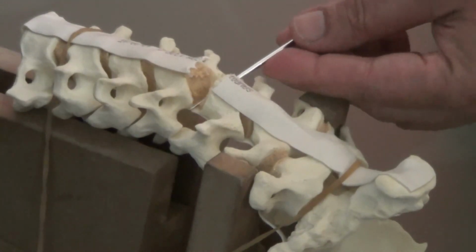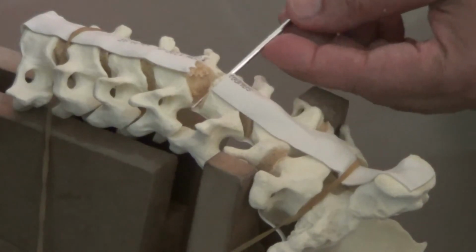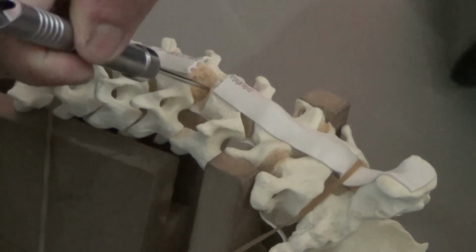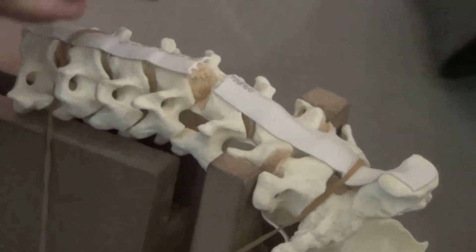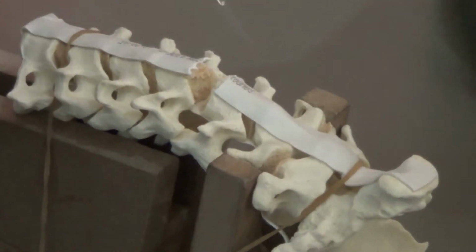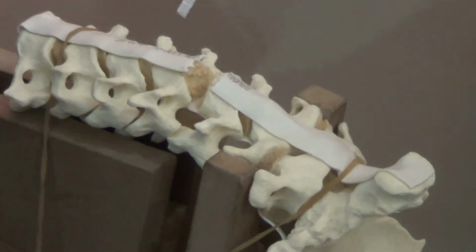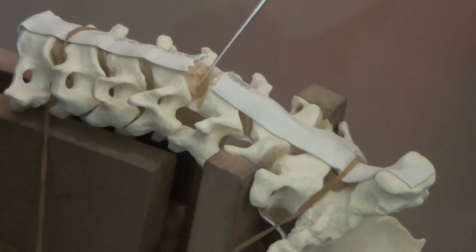You can feel there is no pressure over the dura. Say this is the left side, no pressure on the left side, and you can feel the right side, but not that much. Otherwise you can injure the vertebral artery. So just very gently you can feel, yes, there is no pressure, there is no discomfort, nothing is there.